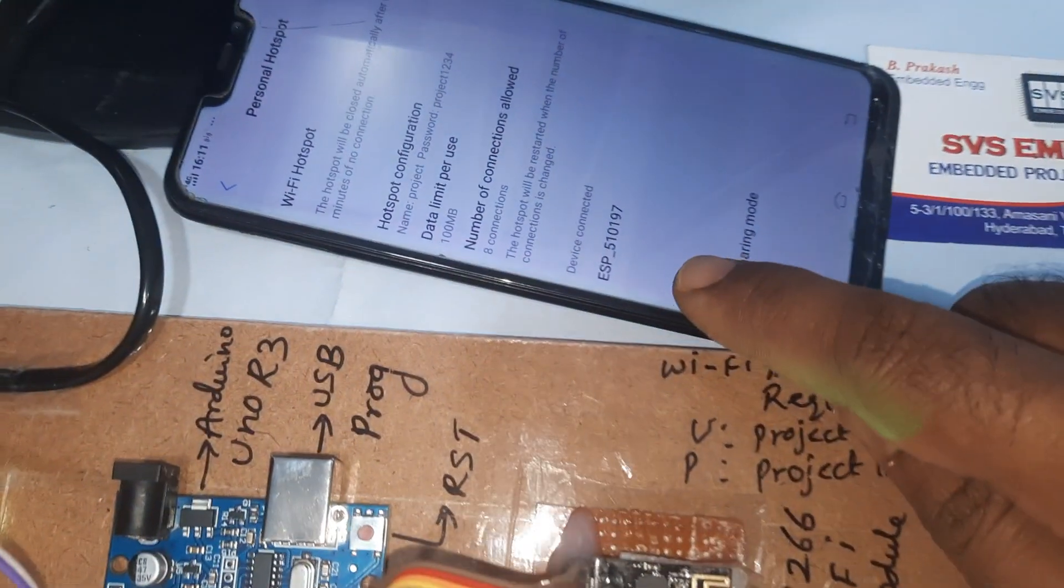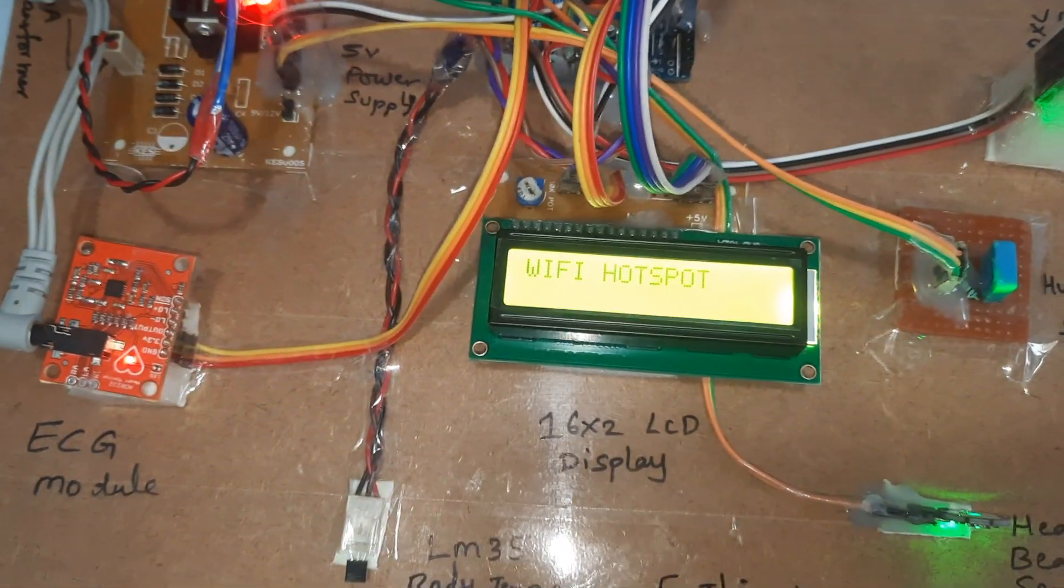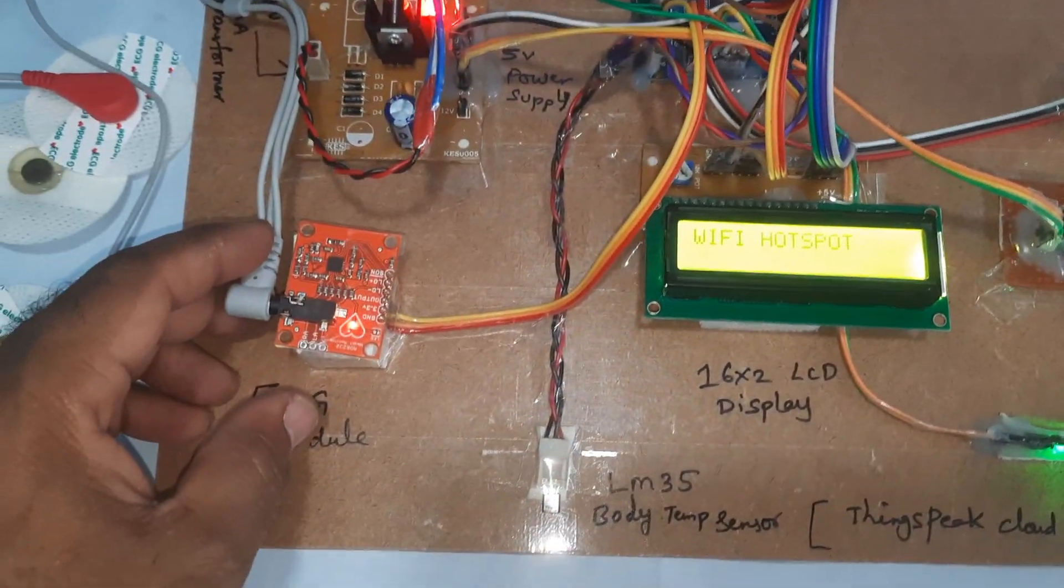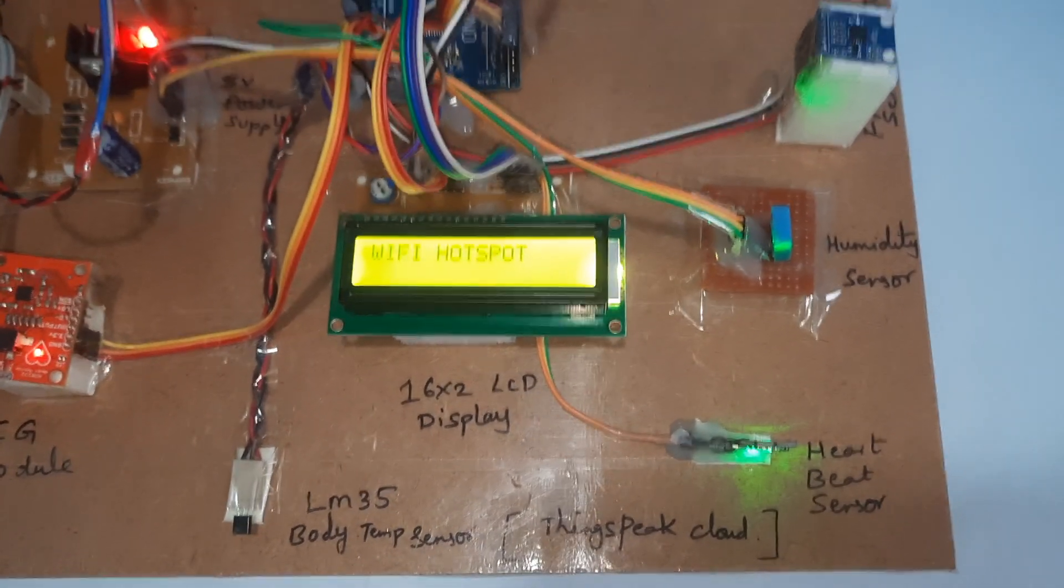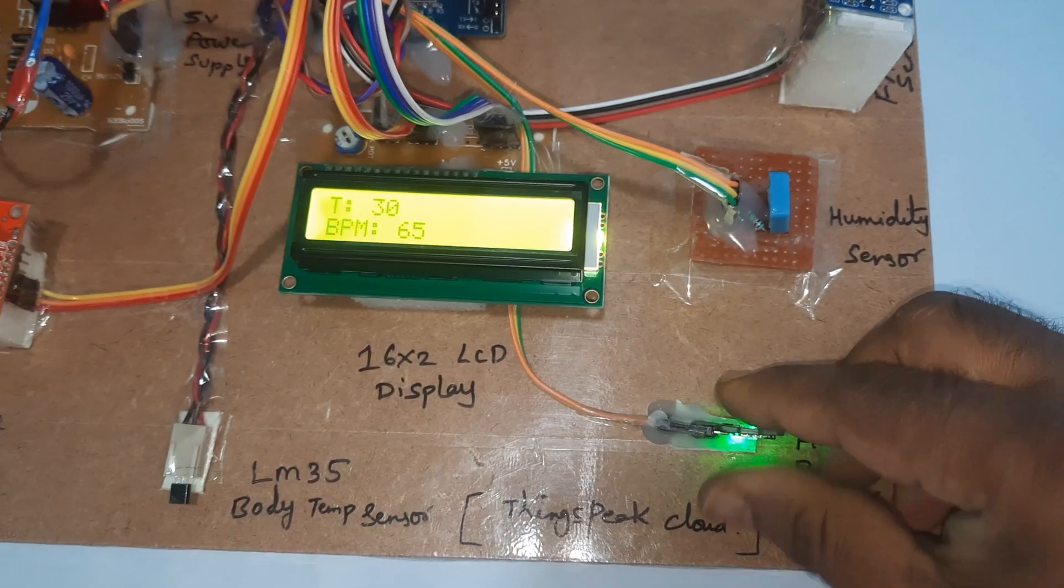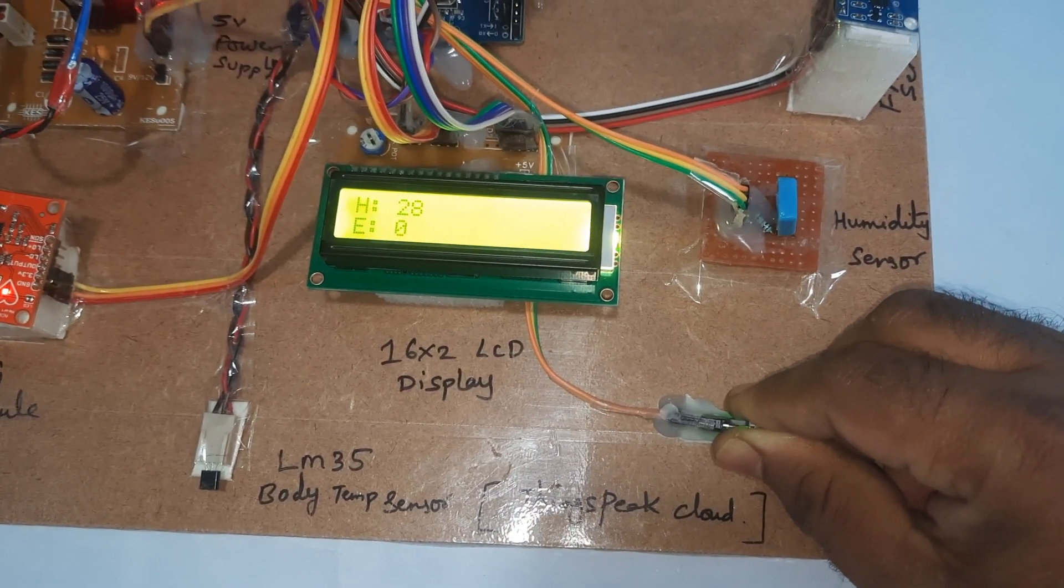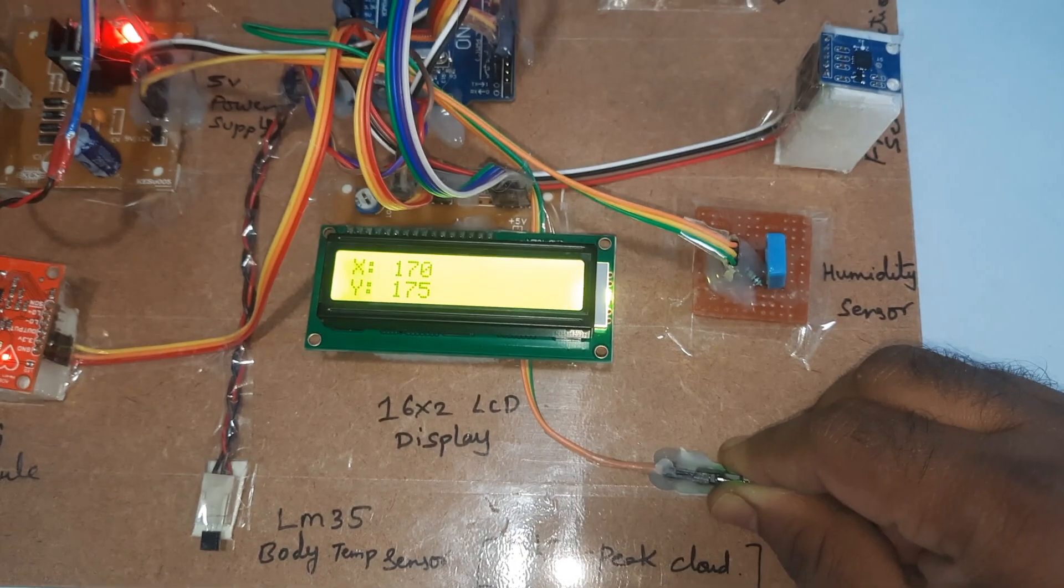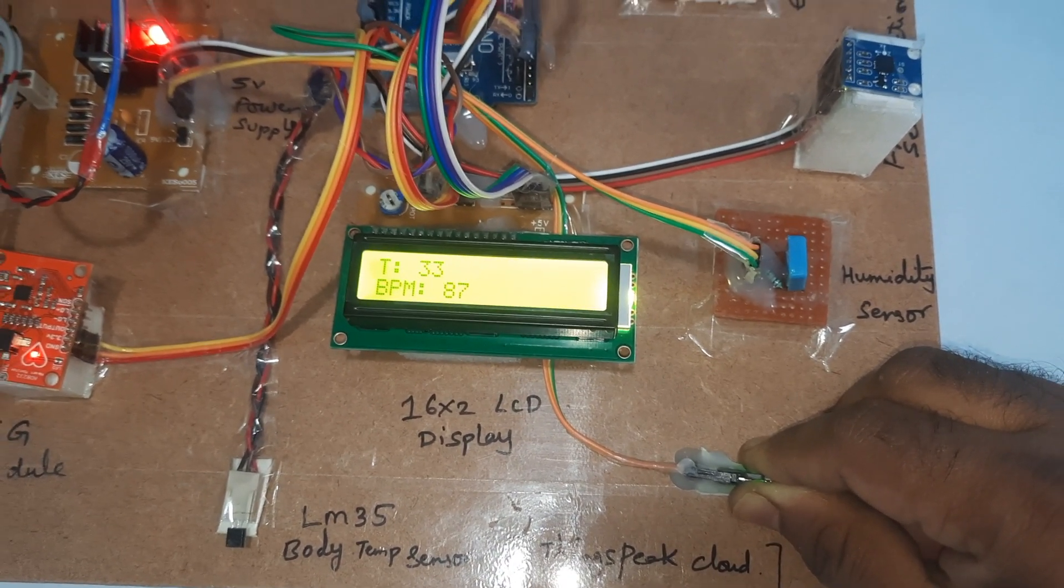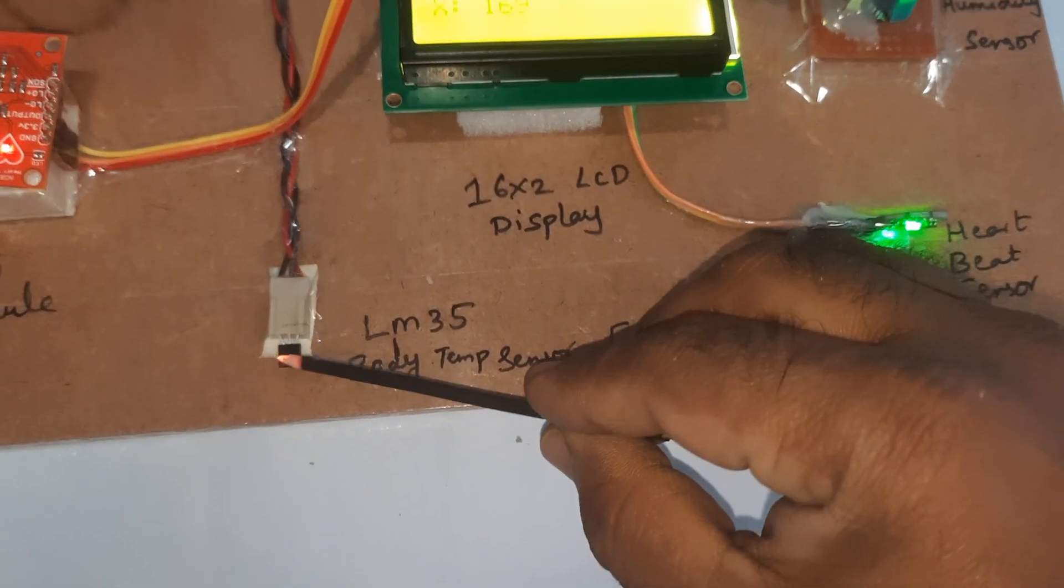Here ESP8266 Wi-Fi hotspot module is connected, along with ECG module, LM35 temperature sensor, heartbeat clip, and humidity sensor. On the display: H for humidity, E for ECG, F for fall detection, BPM for heartbeat, and T for temperature. Now I'm going to increase the temperature.